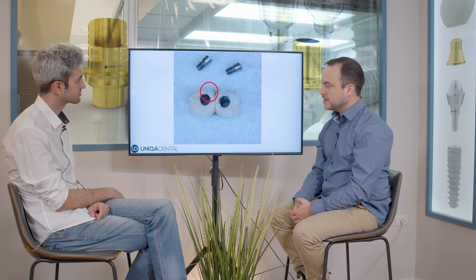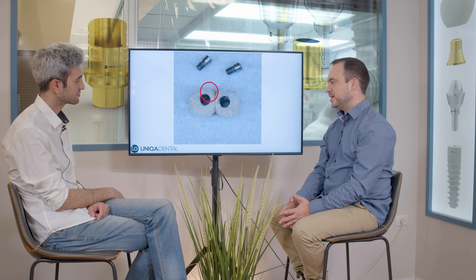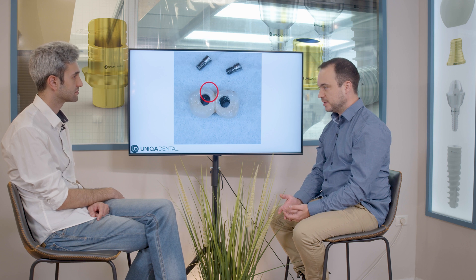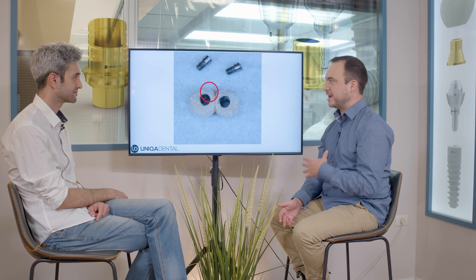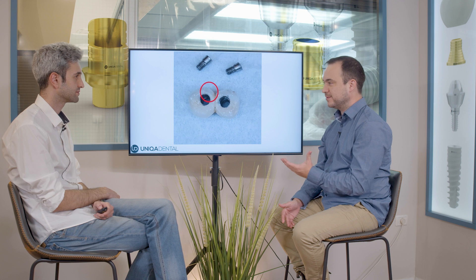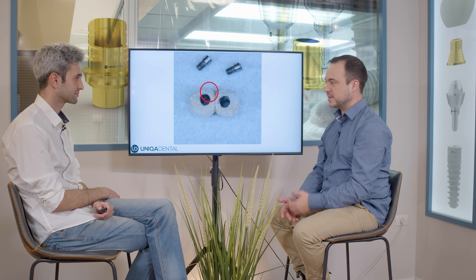When you're making a PFM restoration without sleeves, without anything, the screws must go through the crown. So the screw channel needs to be in diameter a little bit larger than the head of the screw. If you have a screw of, for example, 2.3 millimeters, you need a screw channel of about 2.5 millimeters — and for a premolar, 2.5 millimeters is almost half of the tooth.